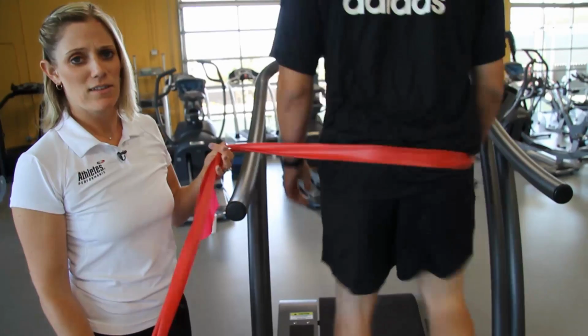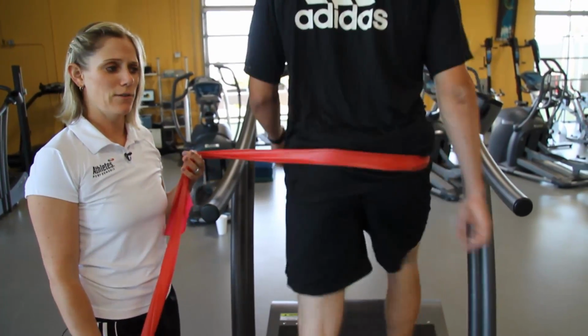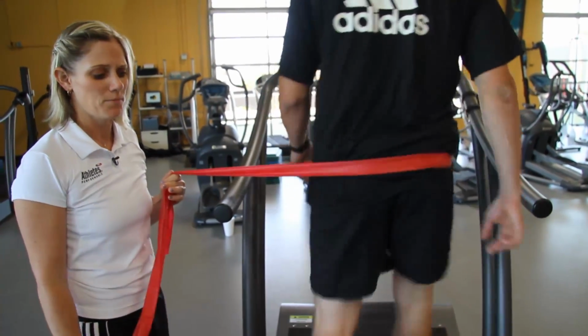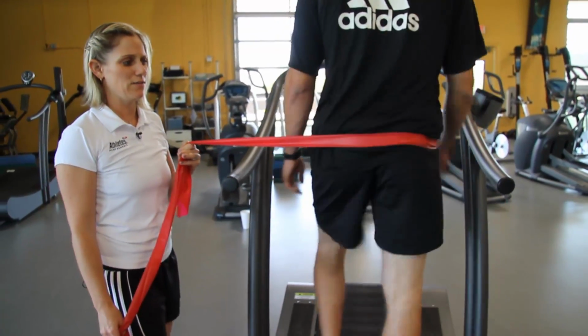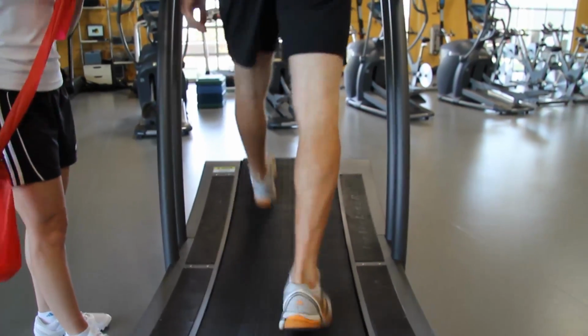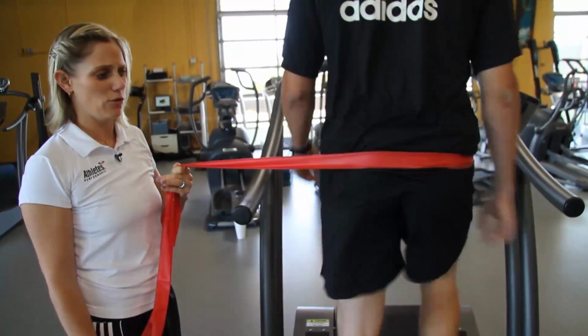I start with the band slack so that I don't distort Matt's movement too much and he can get used to it. Over a few steps, I gently take up light tension, just a couple pounds of pressure in the band, and Matt's mechanics should start normalizing for a more smooth, even gait pattern. And then I cue him to let his arms swing naturally, to walk strong, to walk tall, and to walk with a smooth, fluid motion.